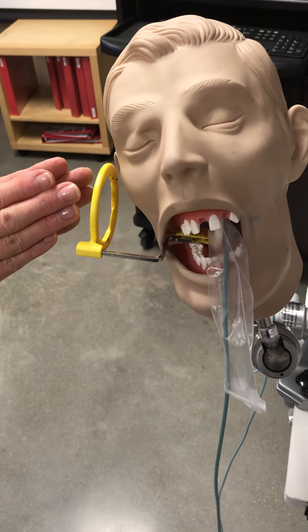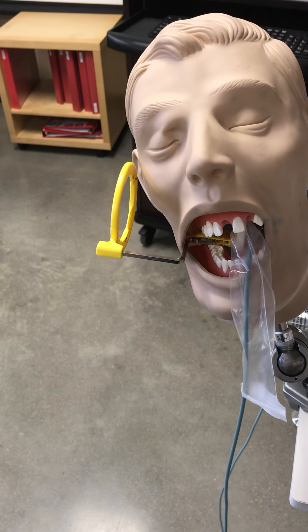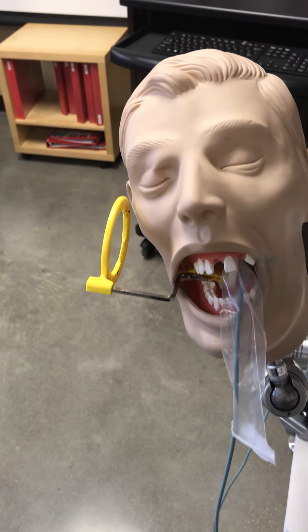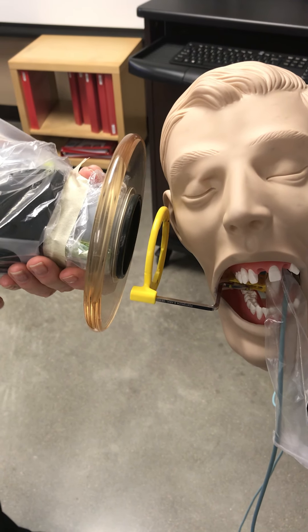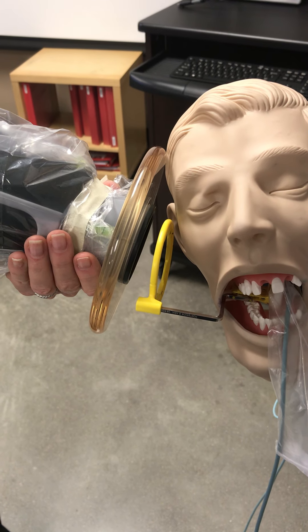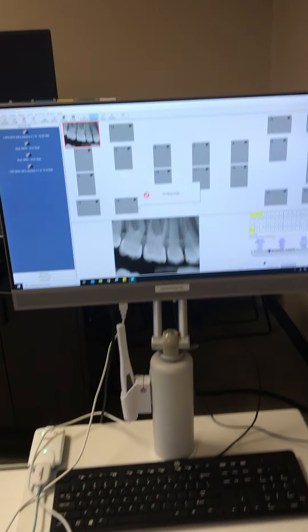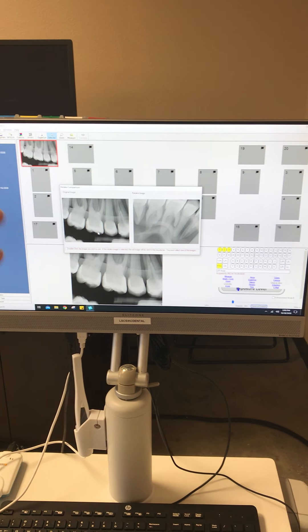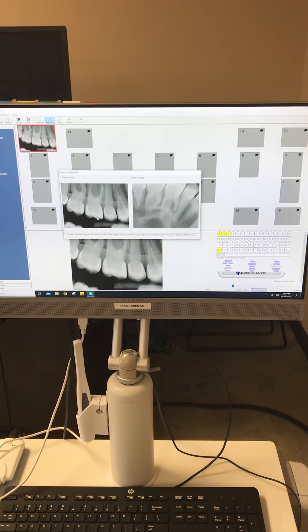Like this, so when I elongate or capture the apices, I'm gonna go this way — so it needs to be on 12mm. The teeth don't sit like this, they sit like this. Now let's see what happens over here. Okay, I cut it off — I angled too much — but this, for you, I'm happy with you.